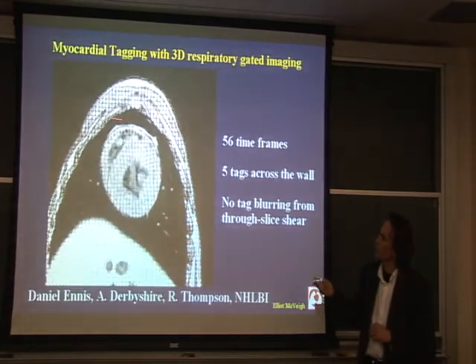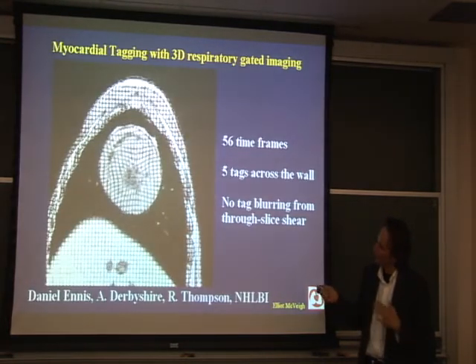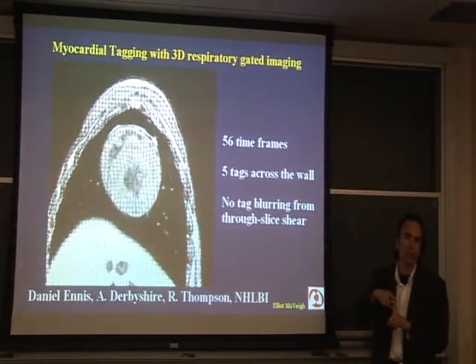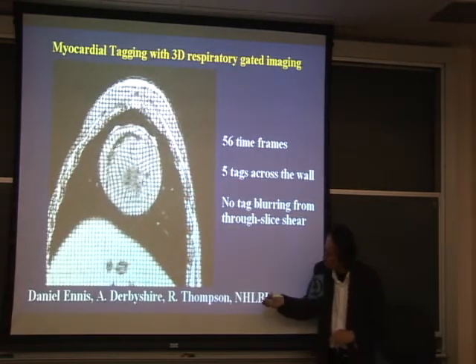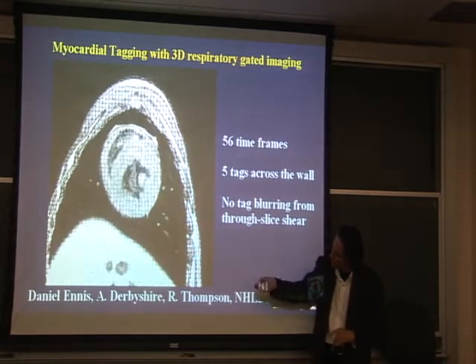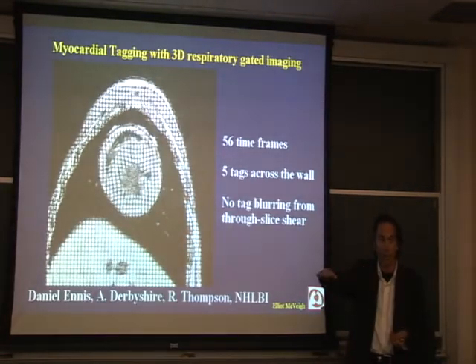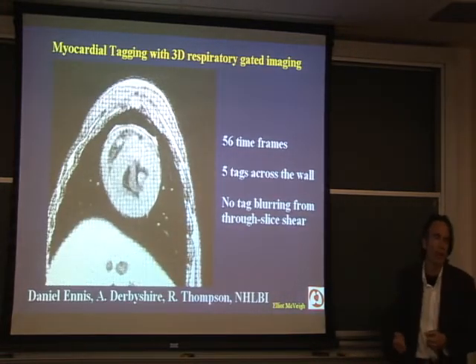This is a movie of what's called myocardial tagging. What happens is that at end-diastole, or say a QRS complex, the QRS is going to trigger a set of radio frequency and gradient pulses in the scanner. And what they're going to do is cause parallel lines of magnetization in this animal. The liver, the animal, the left ventricle, parallel planes through that animal will be saturated so that no signal will come from those planes for about half a second.